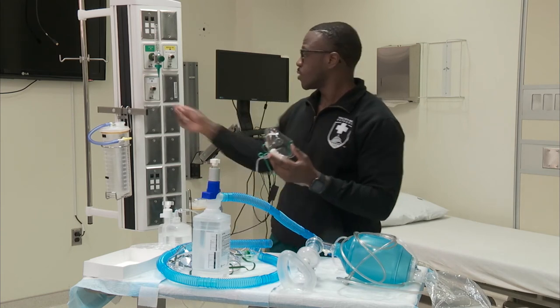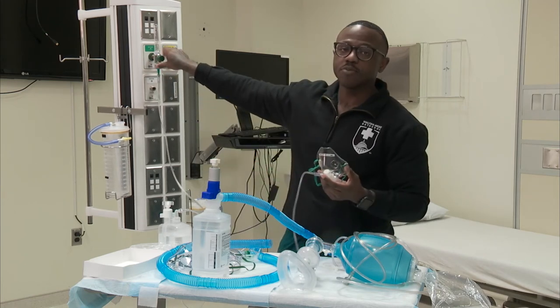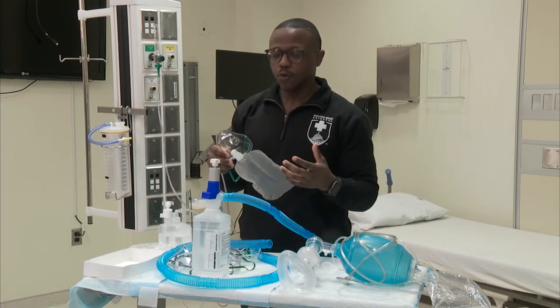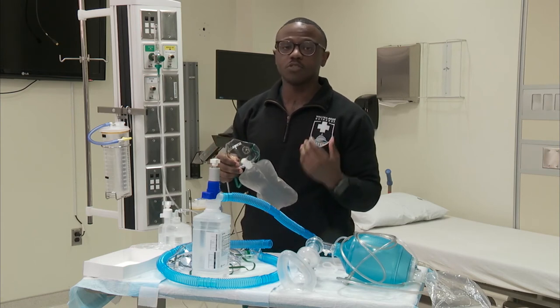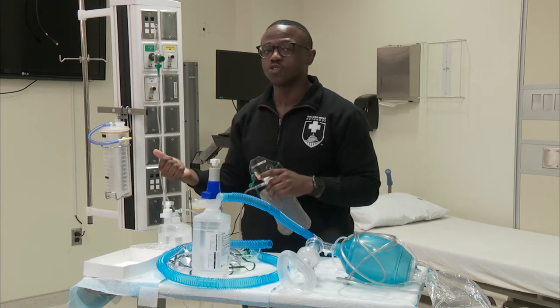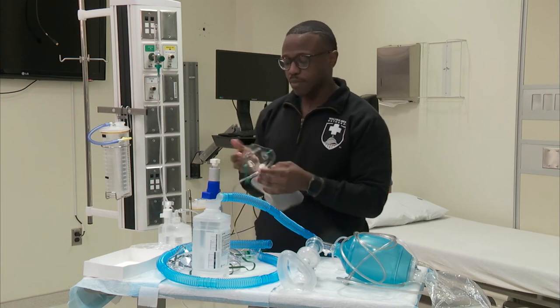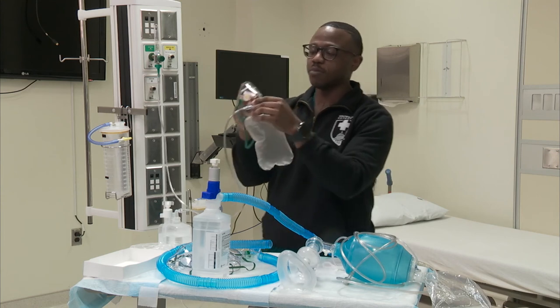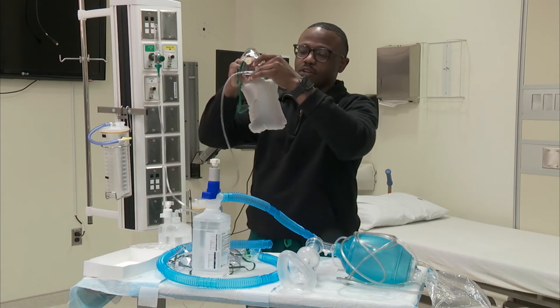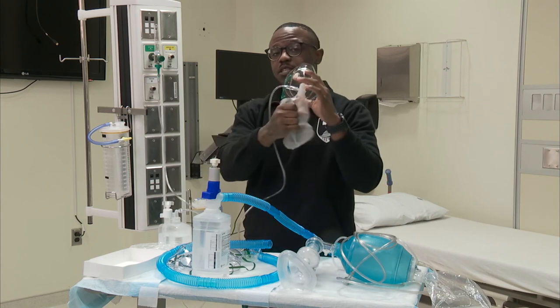When you're getting ready to place this mask on a patient, turn it to 15 liters. You might think that's 100%, but it's truly not 100% because you can't account for the patient's respiratory rate and tidal volumes. Unless you have an endotracheal tube or a tight-fitted mask like a CPAP or BiPAP mask, it's about roughly 80%. The bag fills up and the patient draws directly from this bag of oxygen when inhaling.